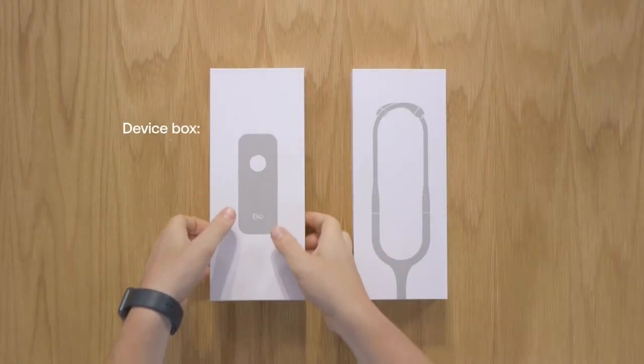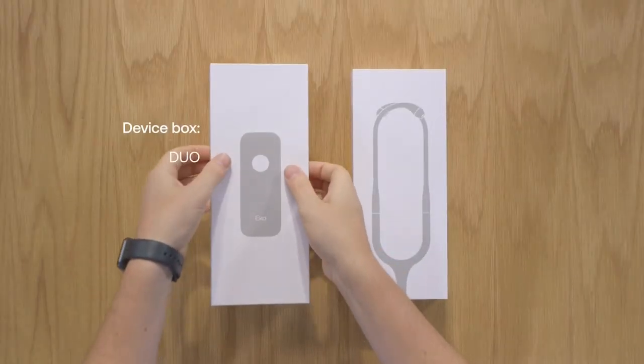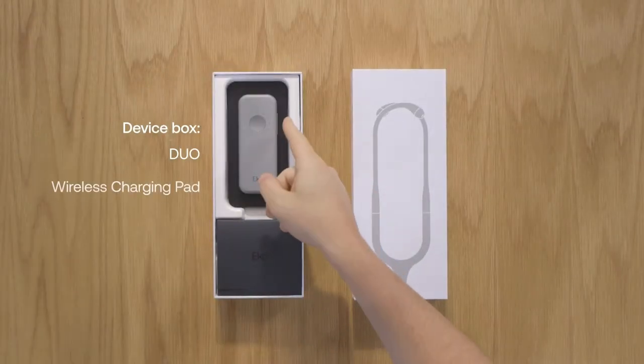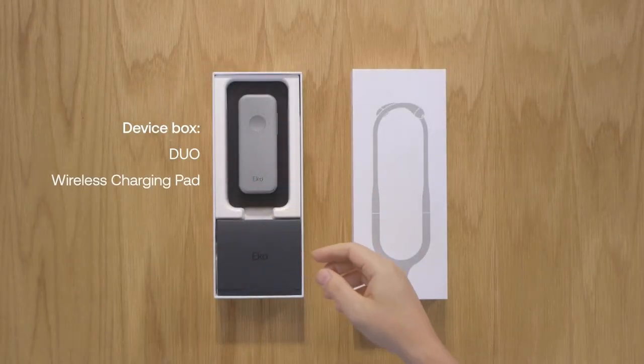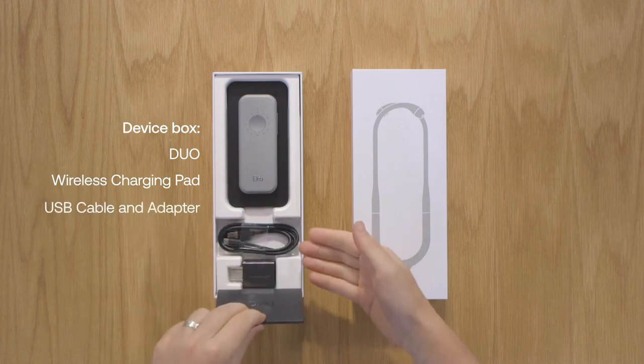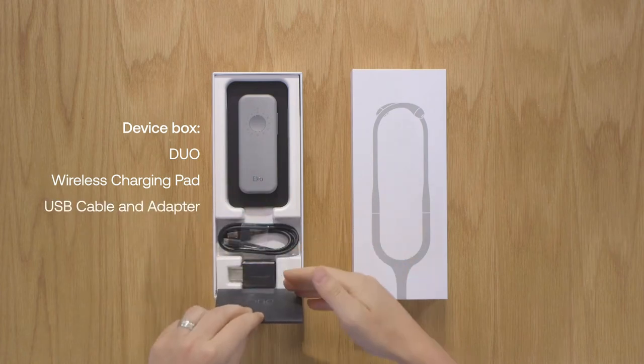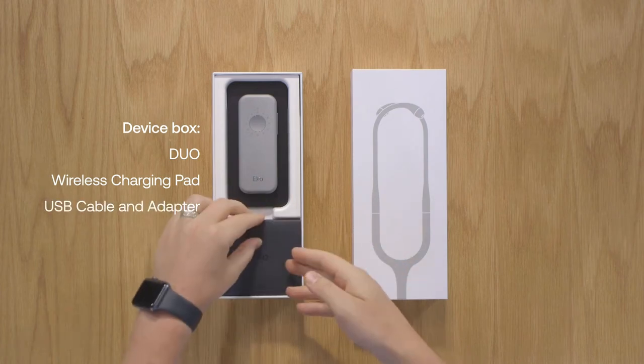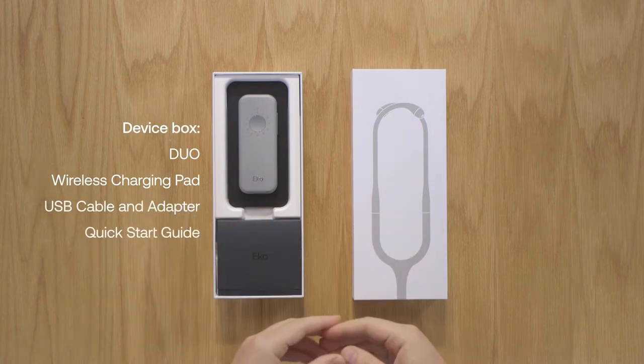In the device box you'll find the Duo, wireless charging pad, USB cable and adapter, and a quick start guide.